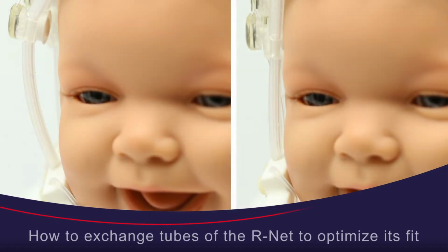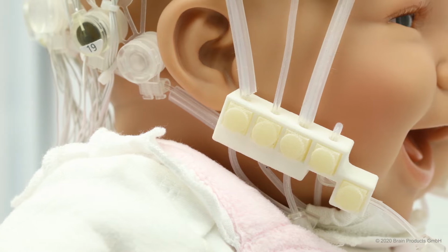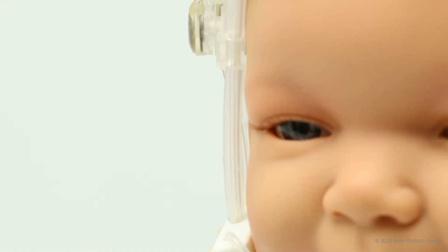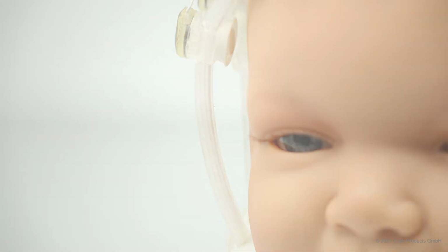In this video, we will show you how to exchange tubes of the R-net to optimize its fit. Find the perfect fit by adjusting the length of the cords such that the clamping block is aligned with the jawbone and that all the electrodes are in close contact with the skin. If this is not possible, you can also exchange the tubes.